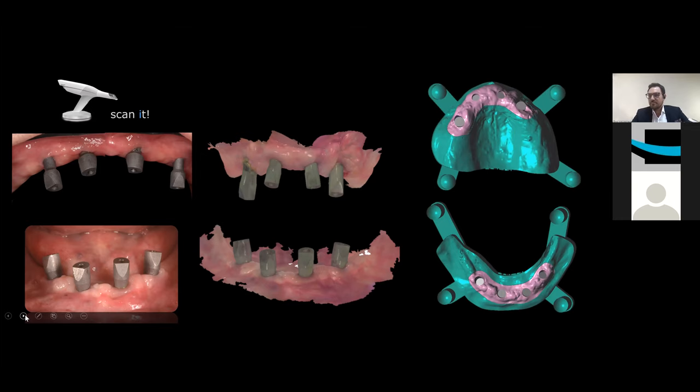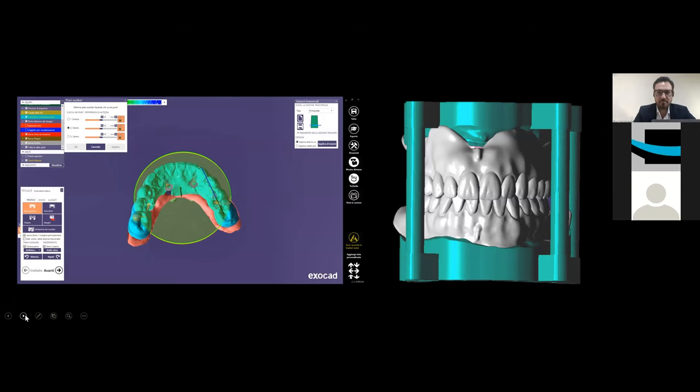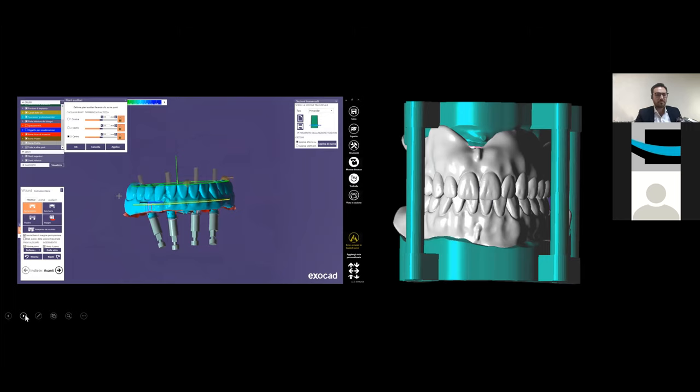And I prefer to build a digital model. I don't use stone models in this step of my technique. With my colleague Marco Ortensi, I prefer to use a digital model, but I want to control my bar inside the mouth. So I do the final project of the bar with the edentulous, and you can see how easy it is to get the final shape of the bar when you have the final volume. During the first visit, we collected data to get the final volume of the patient with a prototype.